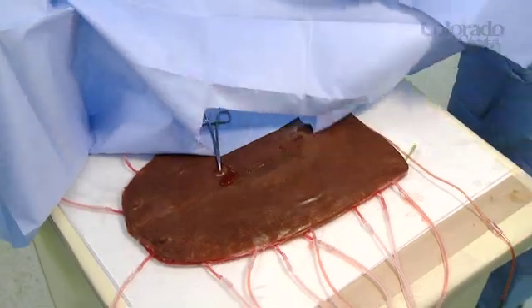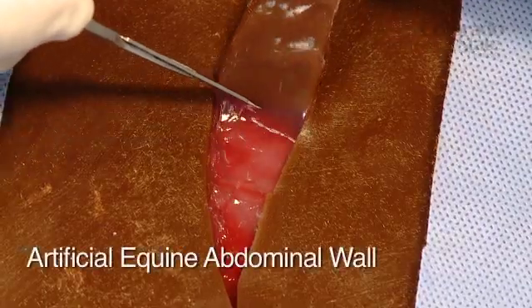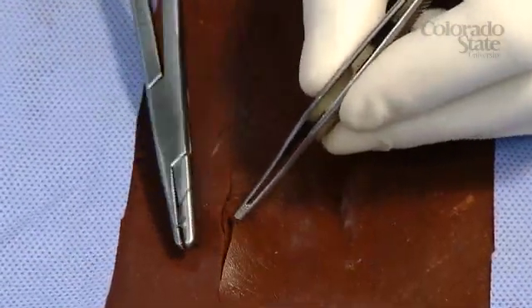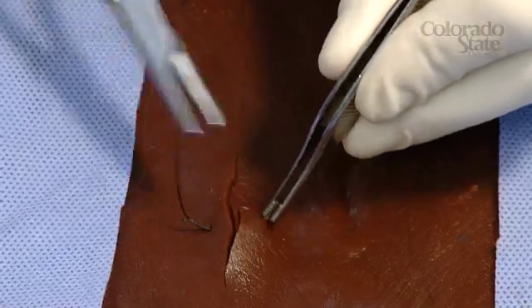Wow, that looked real, didn't it? When you take the drapes off, all it is is a simulated model. We've been working here at Colorado State University to develop a way to train our students in veterinary medicine to develop surgical skills using better, more advanced technologies that don't involve the use of live animals.